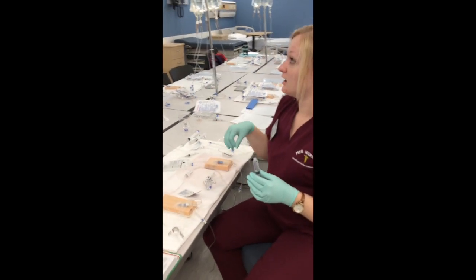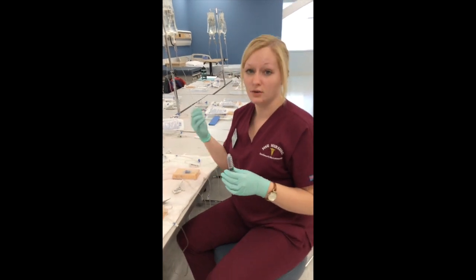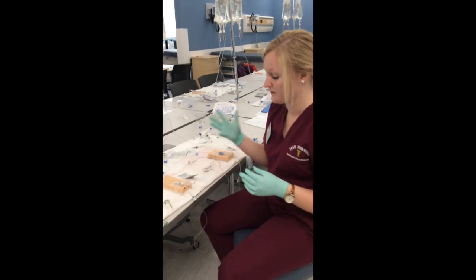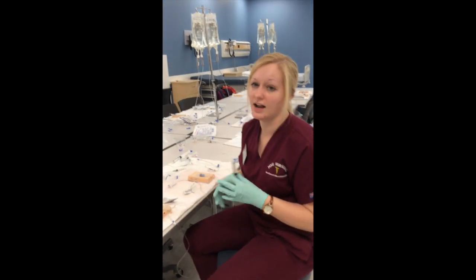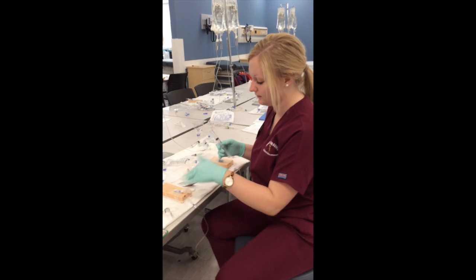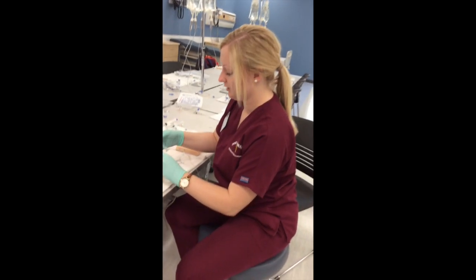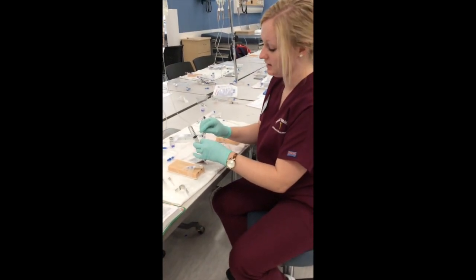Since there is normal saline already infusing, I don't need to flush it, but if it were a hep lock or a saline lock, it would be really important for me to do like a 5 milliliter flush to make sure I get any previous medications out of the line. So, like I said, theoretically I would clean the port with a hep lock or saline lock, and I would flush it, but since this is already infusing, I'm just going to clamp it. I'm going to get a new alcohol wipe, and I'm going to clean it for 30 seconds.